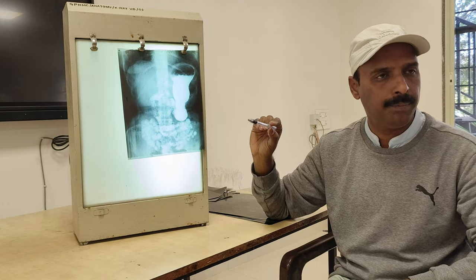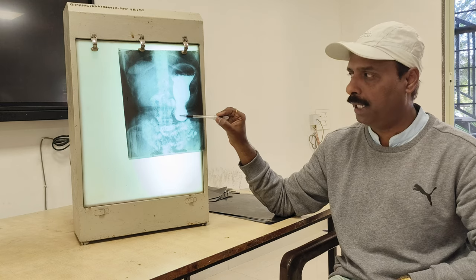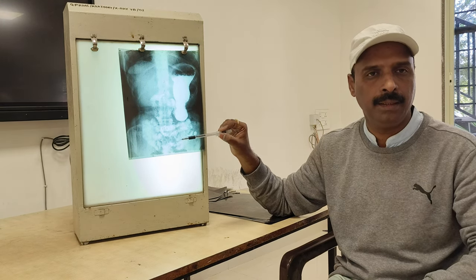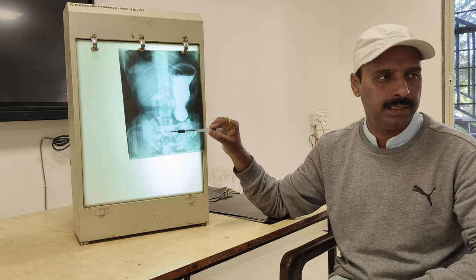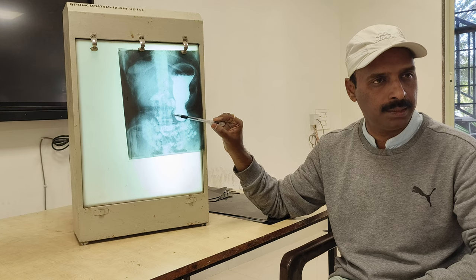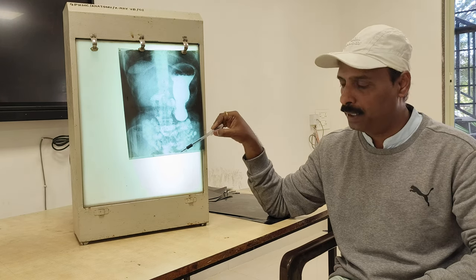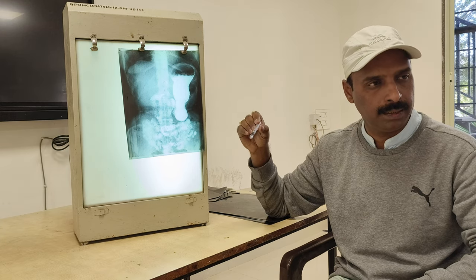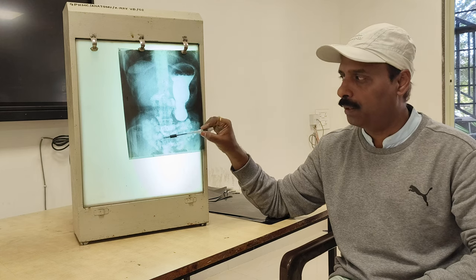A comment on this: it is a barium meal x-ray or barium follow through, where you can see the parts of the stomach: fundus, body, pyloric antrum, pyloric canal, and this is the second part of the duodenum and small intestine. So if barium reaches the small intestine, you have to explain that it is a barium follow through. Still this is the barium x-ray where you can identify the ileocecal junction. From the duodenum to the ileocecal junction, where the barium reaches, we call it a barium meal x-ray, barium follow through. From the rectum to the ileocecal junction, we do a barium enema. From down to above is called an enema, that is, the rectum to the ileocecal junction.